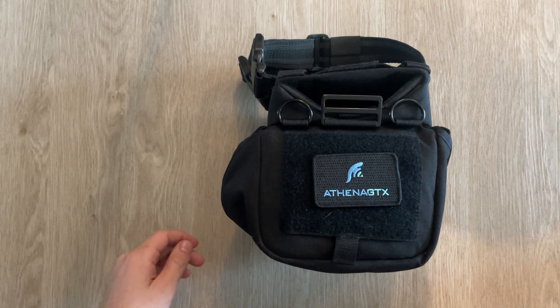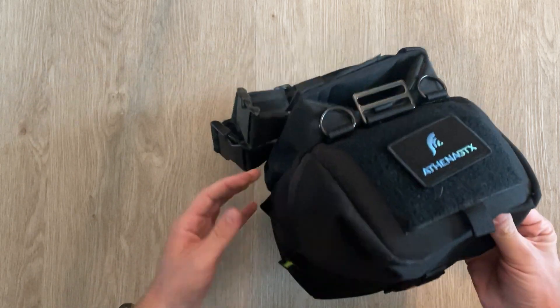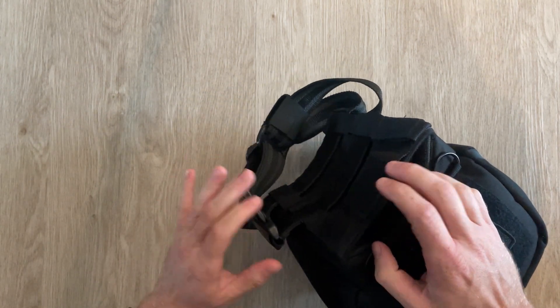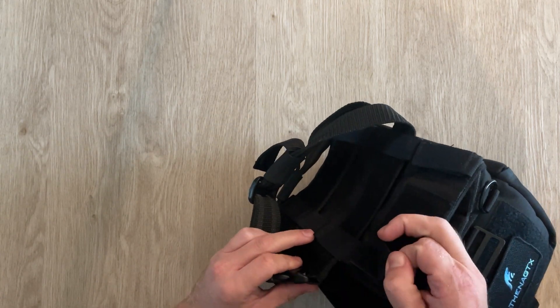Today we have the WVSM from Athena GTX, and as you can see here it comes in this little drop leg pouch. It's got a connector here for a belt, leg attachment, and you can also MOLLE it into different things.